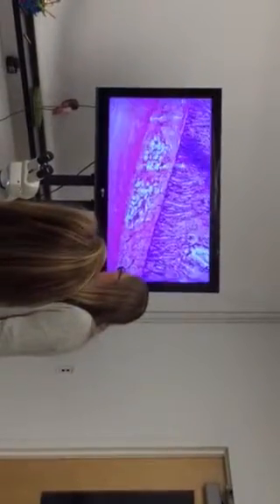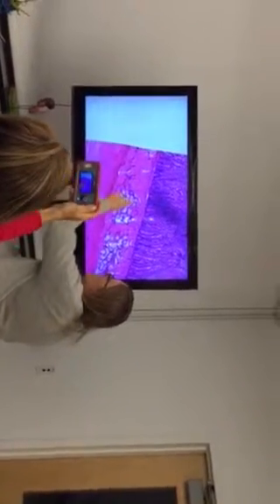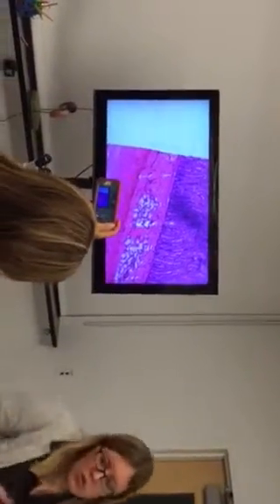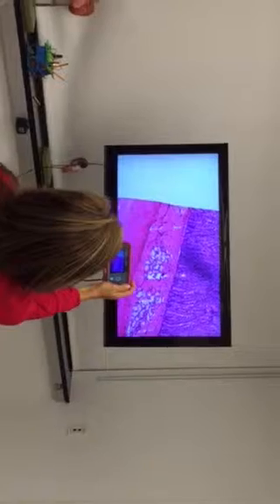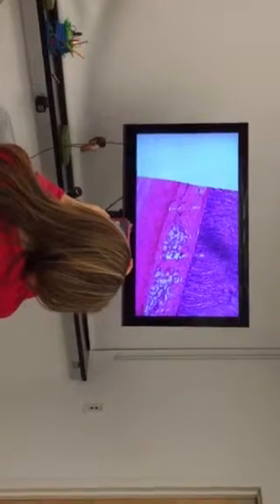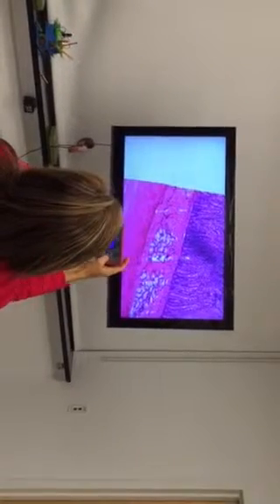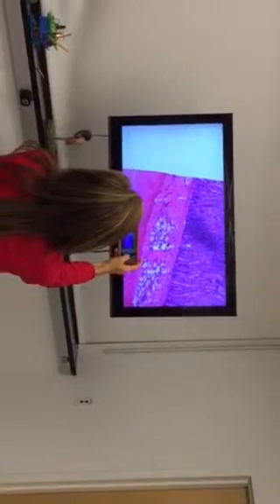Okay. But the submucosa really stands out because it has these duodenal glands, or duodenal. There's alternative pronunciations to it there. So is that different from the intestinal glands? How do I say it? Do I say duodenal? No, I say duodenal. Yes. I mean, are they two different glands? The intestinal. Well, this is the intestine. This is the small intestine specifically, so they're just being specific. The large intestine has glands too, and the submucosa.